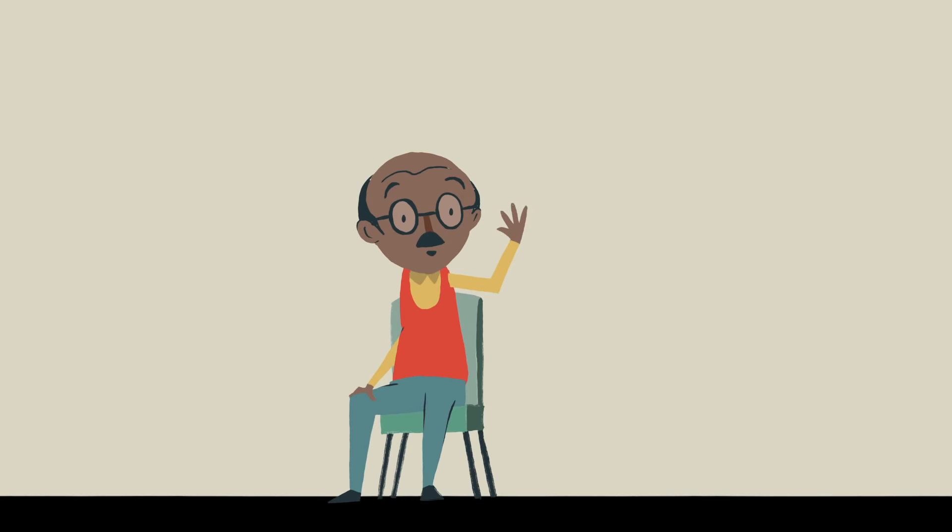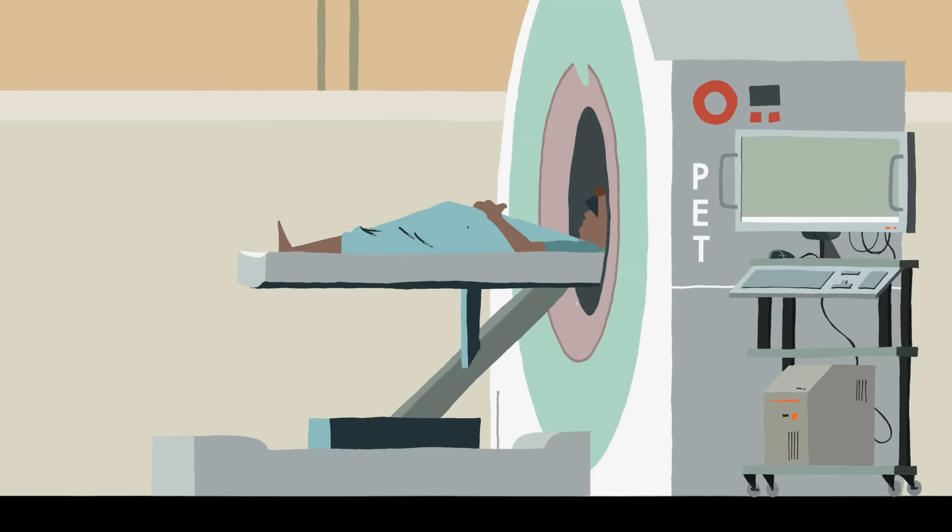Meet Dave. He's about to have a brain scan. Using the latest PET imaging technology, doctors will see Dave's brain at work.